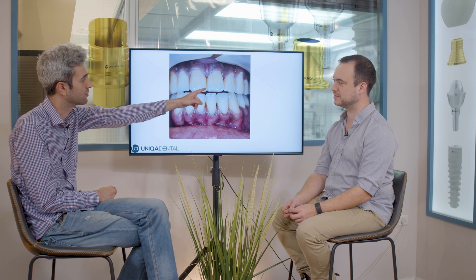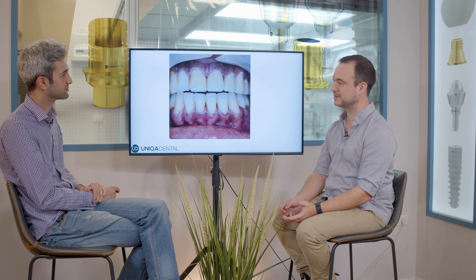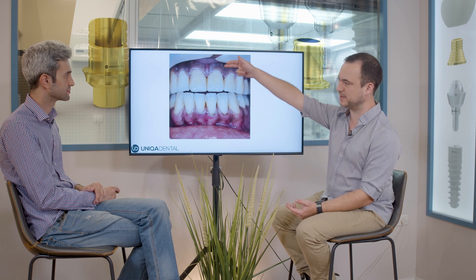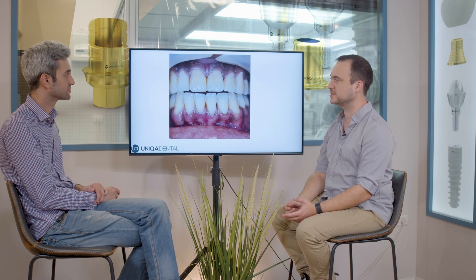Why was it important to not have cement residue at the midline? Because you can see them. The most important part is the residues of the cement that go between the crown and the gingiva — these are what cause inflammation and a lot of different problems. These we clean with the dental floss. And the color looks the same. Everything looks good.